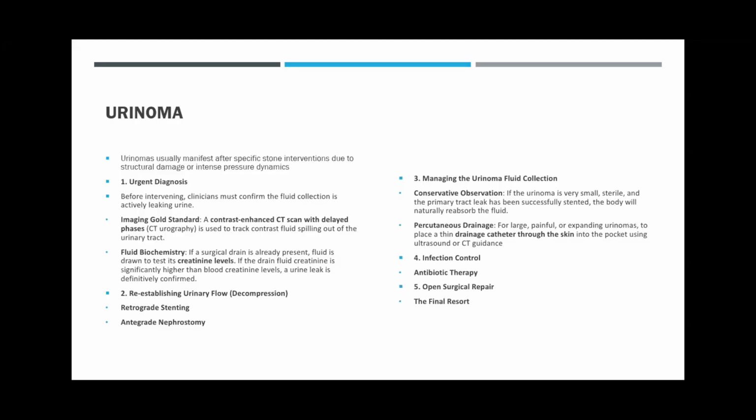And the imaging gold standard is a contrast-enhanced CT scan with delayed phase, and it's used to track contrast fluid spilling out of the urinary tract.